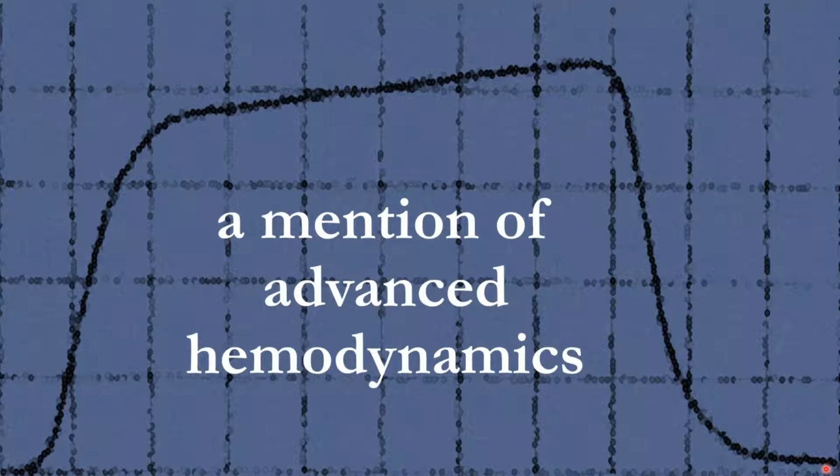So it's something that's definitely not ready for prime time, and maybe someday, if it can be a little more user-friendly, it would be a better tool. Because obviously, perceiving that there's an increased dead space is something that's still useful, but to go to the extent that some of these studies have done to arrive at that conclusion is really laborious, and I don't think we're going to really practically do it.